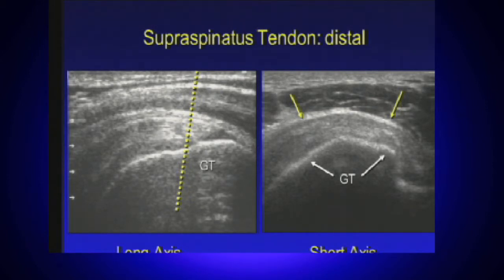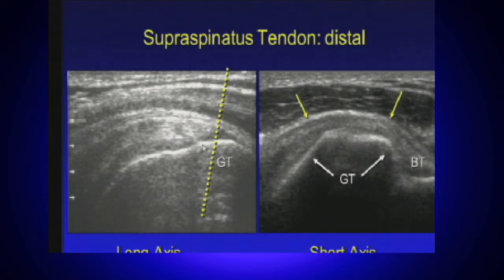As we move even further distally for the rotator cuff, it thins out even more. We now appreciate the superior and middle facets. So the supraspinatus is this structure that's nearly gone. This is all infraspinatus now, coming in at a different angle. So once again, you're looking at the infraspinatus in addition to the supraspinatus with this maneuver.